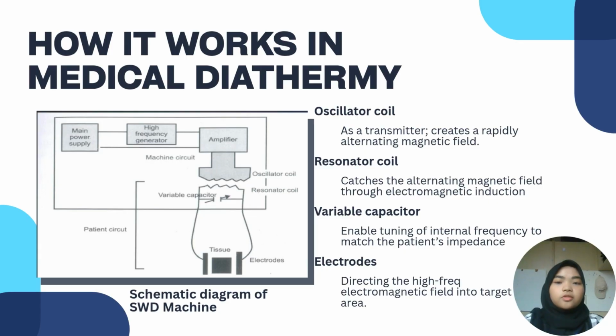A variable capacitor's role is to enable tuning of the internal frequency to match the patient's impedance in order to ensure maximum energy transfer and efficiency. Lastly, electrodes are the physical pads or plates applied to the patient, directing the high-frequency electromagnetic field into the target area.